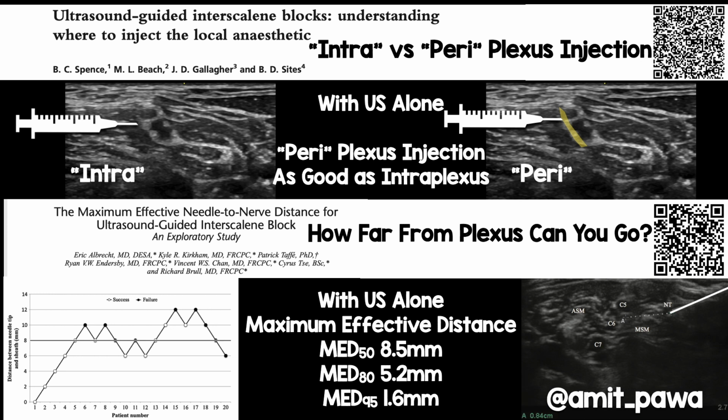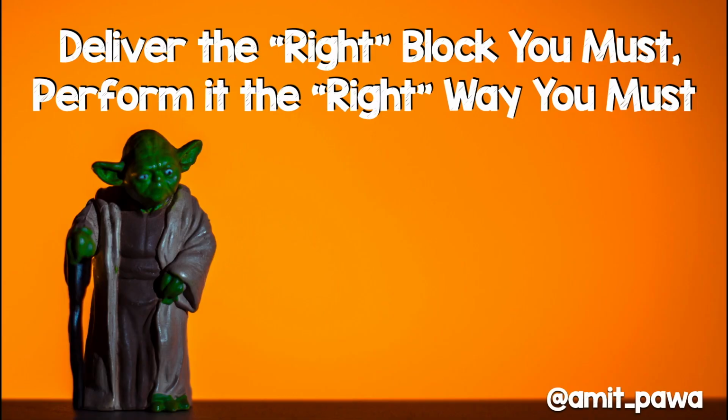So in 50% of cases, you can get a successful block if your needle was actually within the middle scalene muscle. But look, even for an MED of 95, you could be 1.6 millimeters away from the nerves. So we don't need to be that close. So all we need to do is to deliver the right block in the right way.